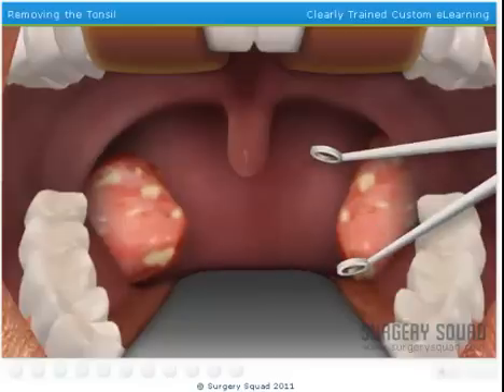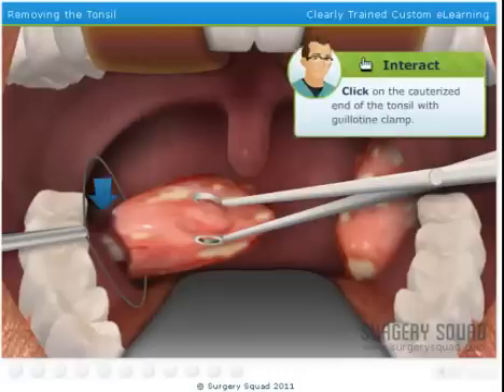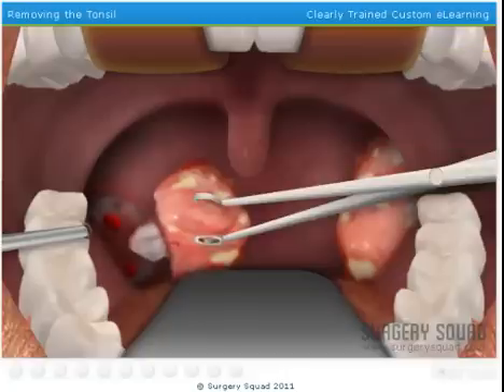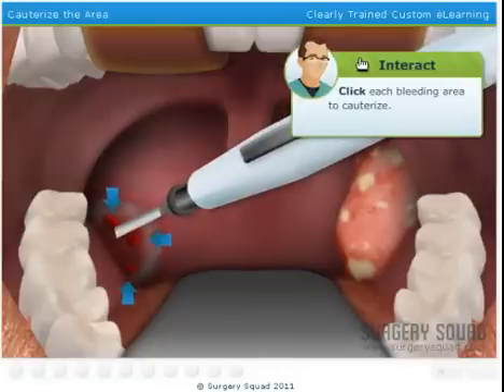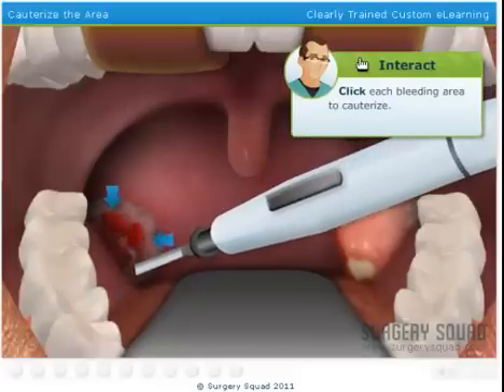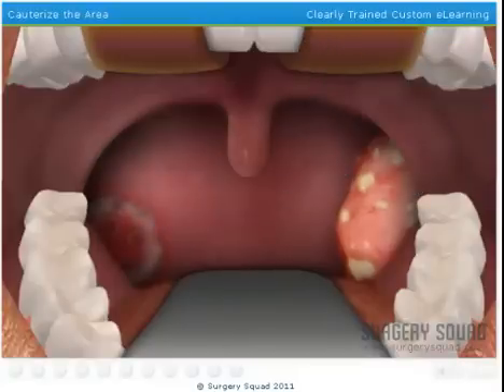Now that the tonsil has been cauterized, we reach in with a tonsil guillotine clamp. The clamp severs the last of the connective tissue and allows us to remove the tonsil from the throat. Clamp the tonsil and pull it out. We'll bring the electrocautery device back in and apply it to any bleeding areas. Because this part of the throat heals quickly, we won't need any stitches.